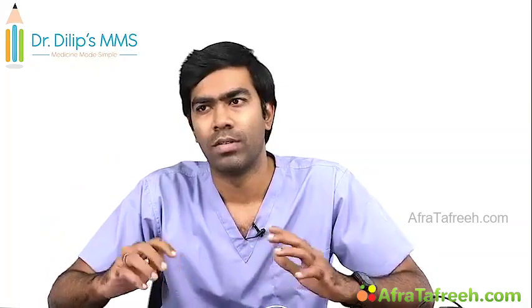Even though these Venturi valves and Venturi devices are getting obsolete, we have other high flow devices which can deliver even more FiO2, more accurately and with a good flow. Still, it's important to understand the Venturi principle. So what is the Venturi principle and how does it affect the flow and FiO2? How can they deliver a fixed and accurate amount of FiO2?